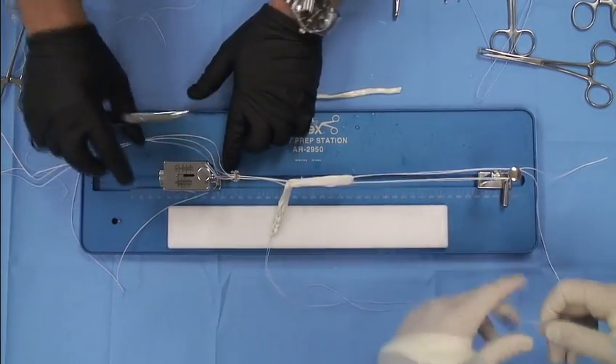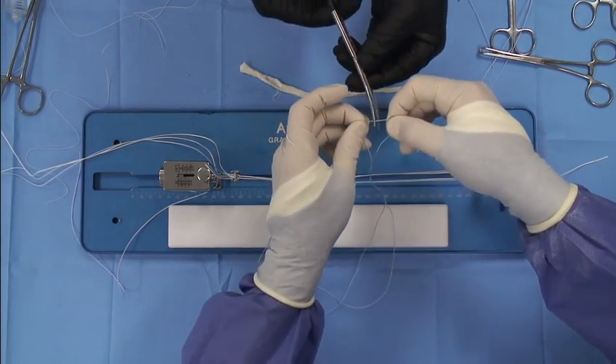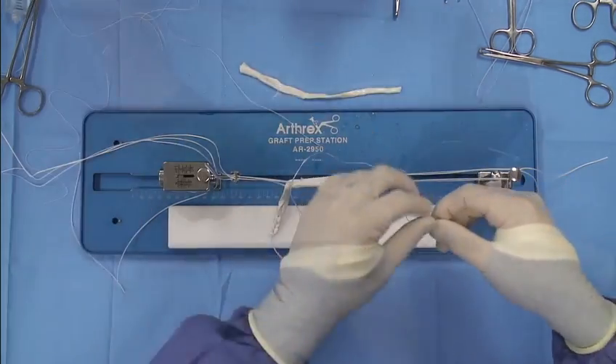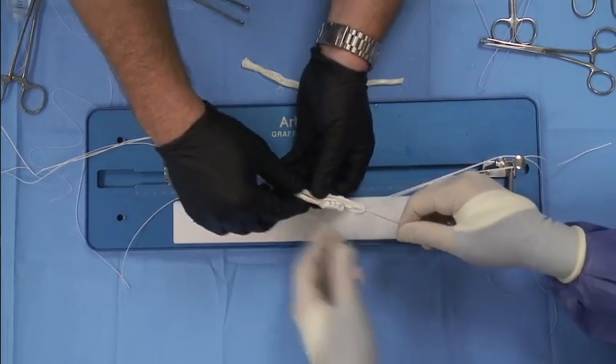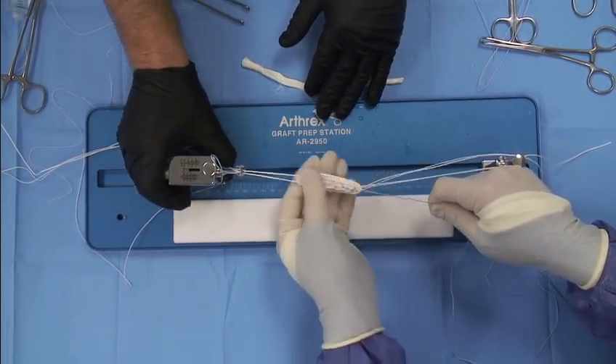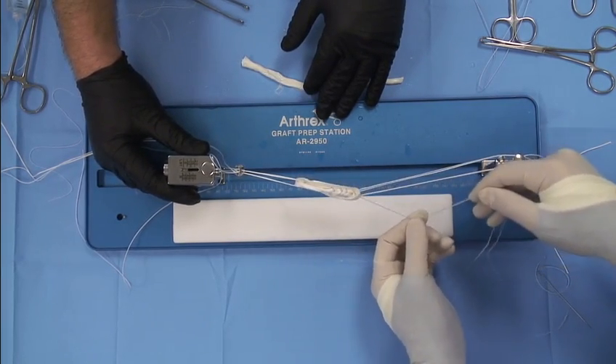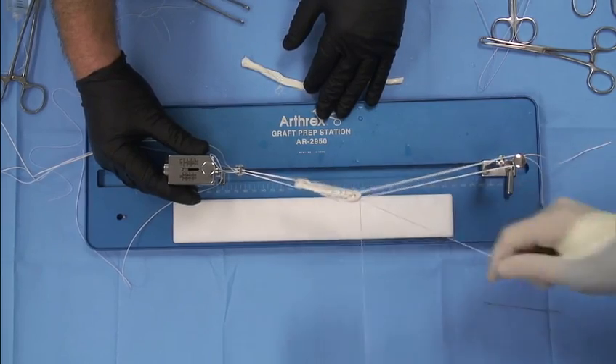And the next trick I like to do is cut the end of the suture but save the metal Keith needle. So we pass those sutures back through the end of the graft, taking care not to touch our button. We'll take the tension off just there so I can pull this all the way seated.